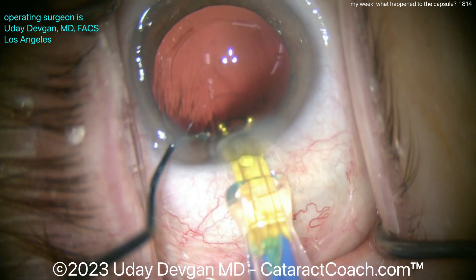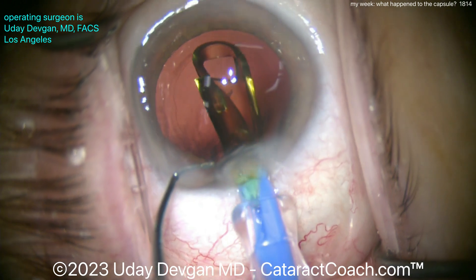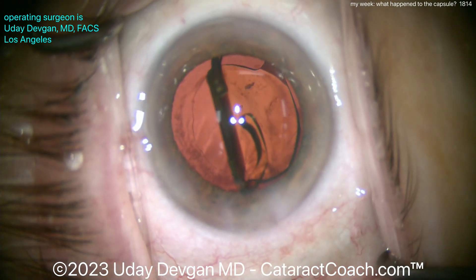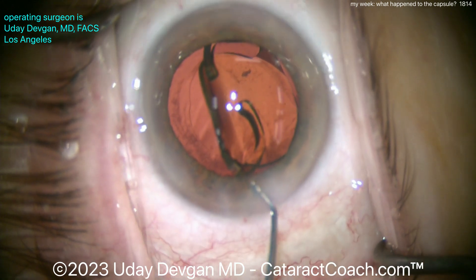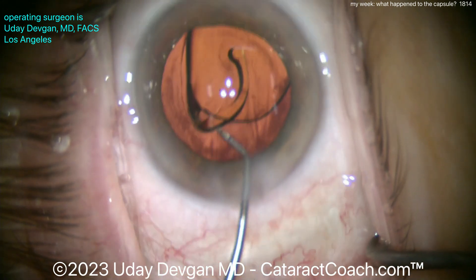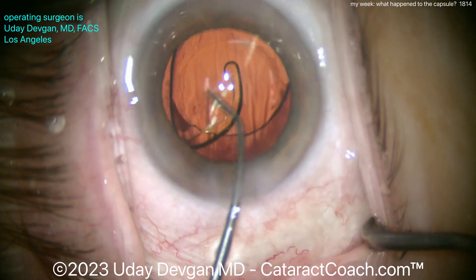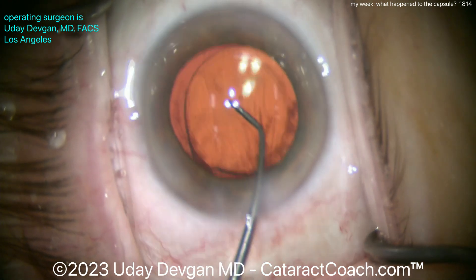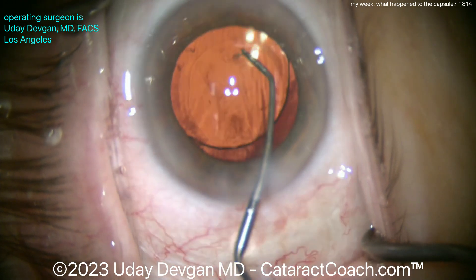I'll deliver the lens here into the capsular bag. I'm not going to do a whole lot more capsule polishing. If you want to do a little more polishing, you can — but let's have the IOL in the bag first. There's a delicate balance between polishing up that capsule and causing an iatrogenic issue.